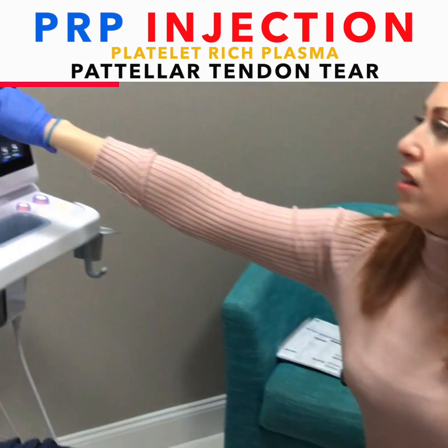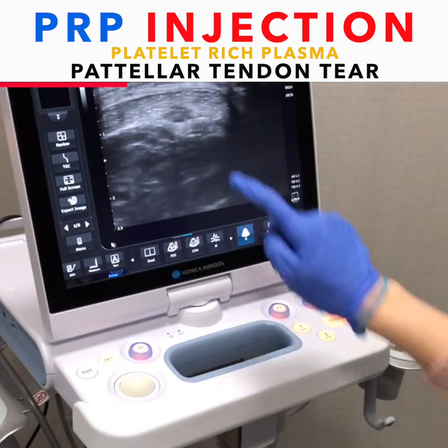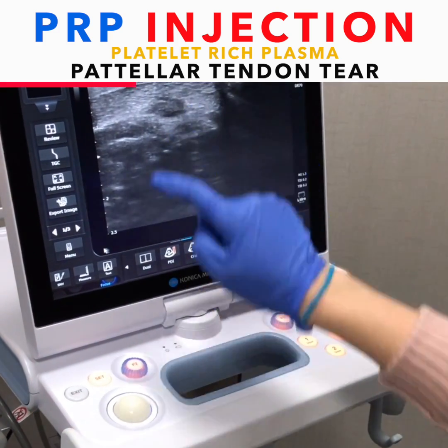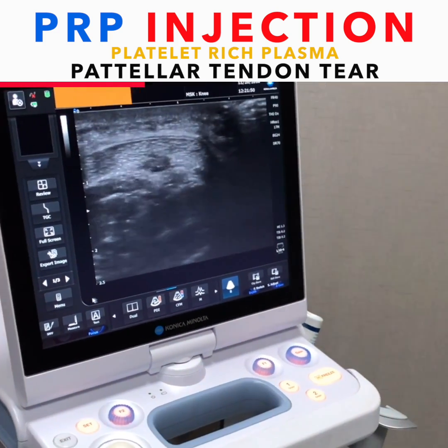Right here is the defect of the patellar tendon. You can see there's like a little hole right there. I'm going to aim the PRP into there, but first I'm just numbing.